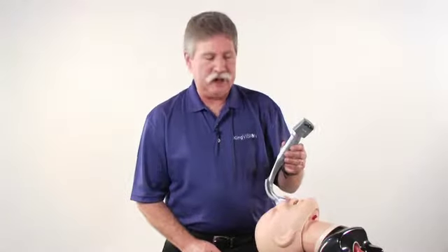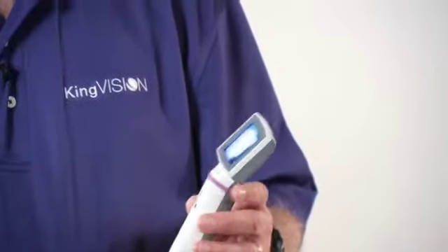The blade curvature was designed to arrive at an appropriate compromise between being able to visualize the vocal cords by looking around the corner without having to manipulate the tissue significantly, yet still allow visualization of an anterior larynx. What this means is that you will not be able to use this blade to directly view the vocal cords, but you should not have to manipulate that much to be able to visualize the cords, even in anterior larynx. Another thing to point out is that the underside of the blade is actually visible on the screen, and this is an intentional design so that there's no blind spot and that there's a landmark as to where you're placing the tip of the blade.